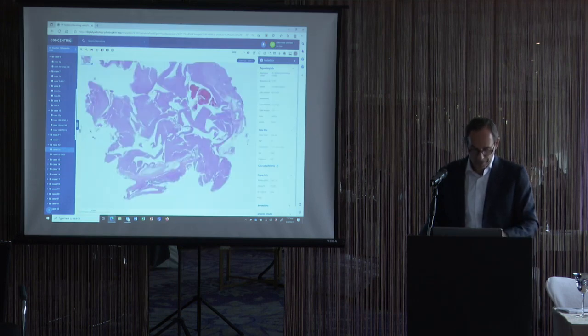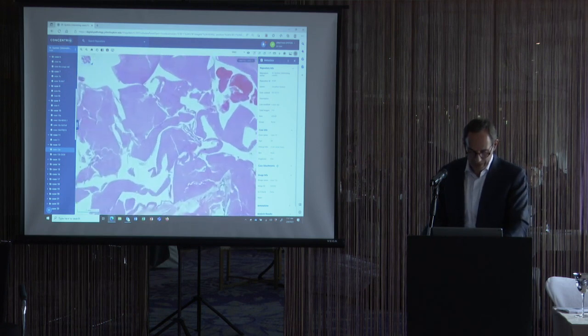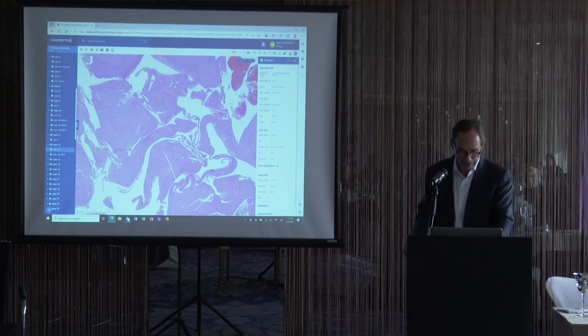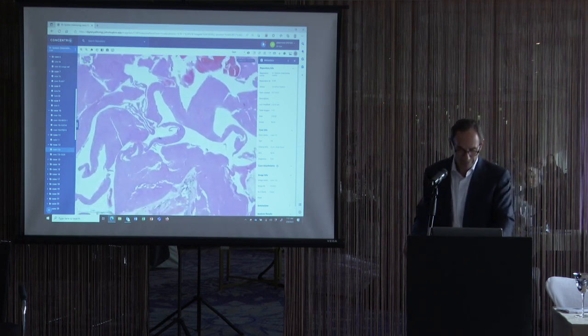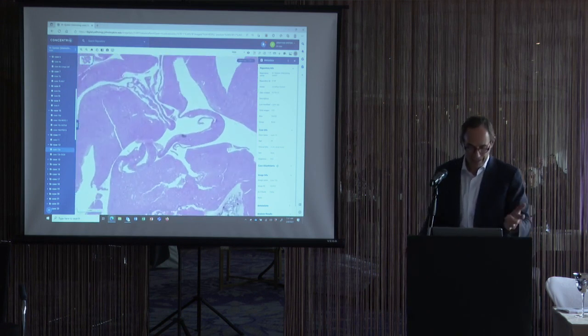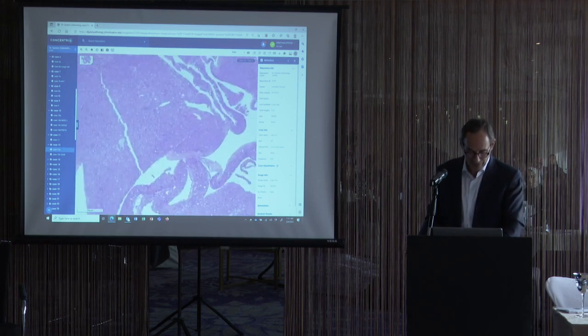So this is a lesion that we can see, a kidney lesion. We've now gone over it this morning, so you guys are all professional renal pathologists, or neoplastic renal pathologists. So what do we see? We see solid, we see cystic, and we see... So it should be an ESC, eosinophilic solid and cystic.